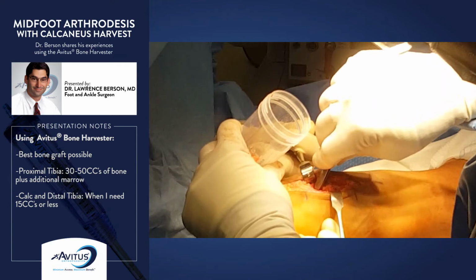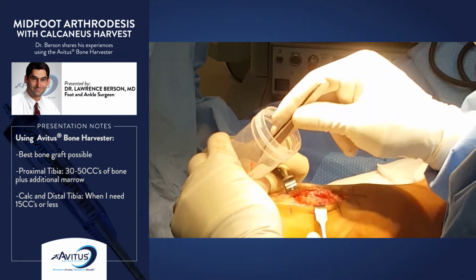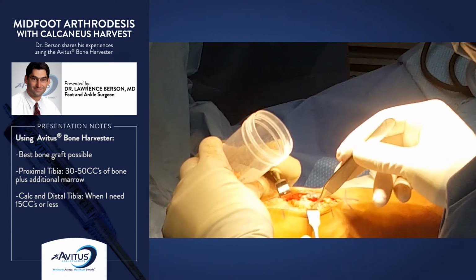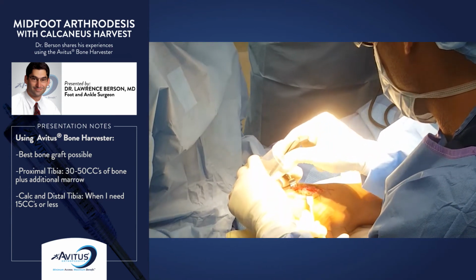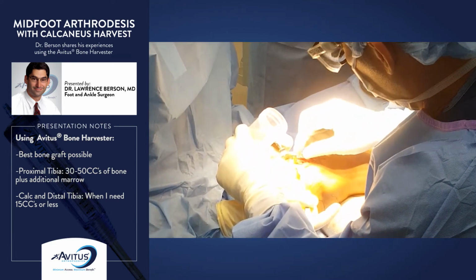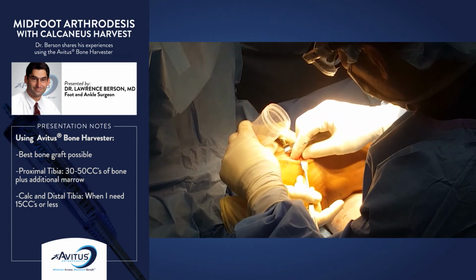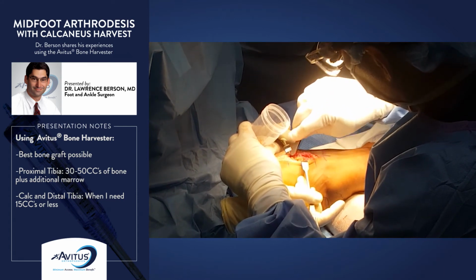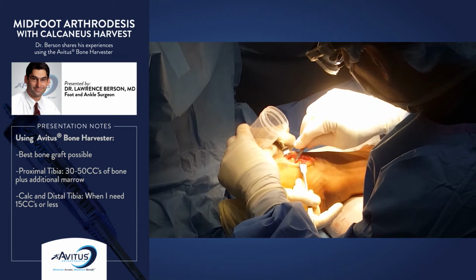If I'm feeling I'm going to need more than about 15 cc's of bone graft, I'll go to the proximal tibia, where I could get probably anywhere from 30 to 50 cc's of bone, plus the marrow, which is nice with the suction. If I need 15 cc's or less, my go-to point would be the calcaneus. The distal tibia is also an option. If you're more comfortable with that, you can get about the same amount of bone from the distal tibia as the calcaneus, maybe a little bit less, because I think the calcaneus does have more volume, but both of those would be for smaller amounts of bone graft.